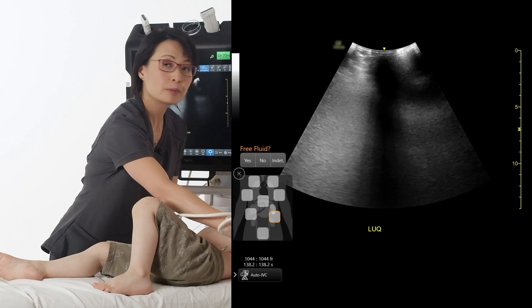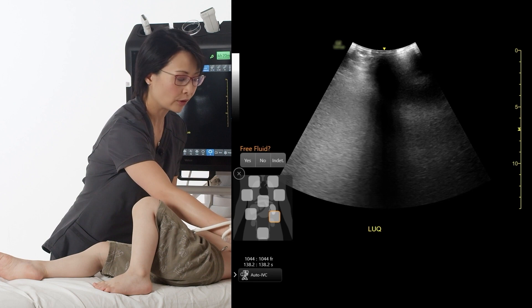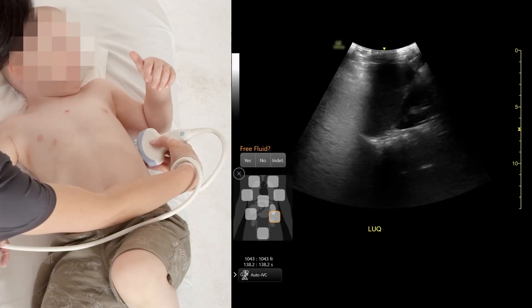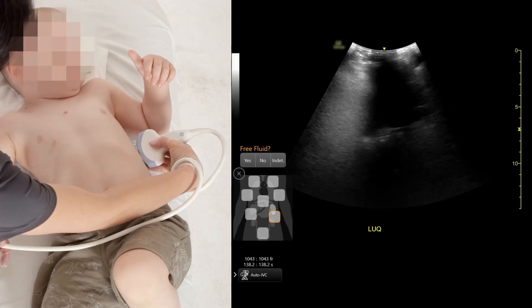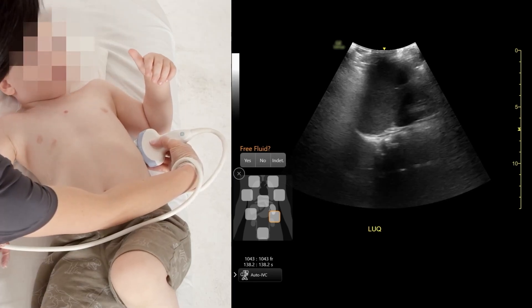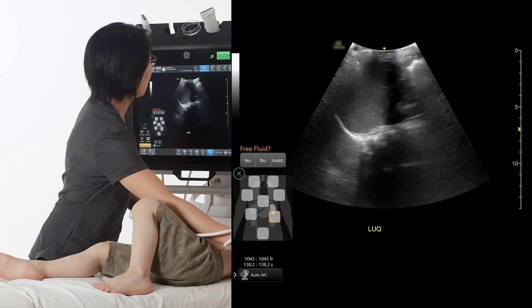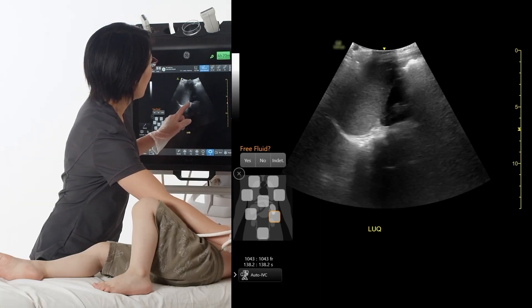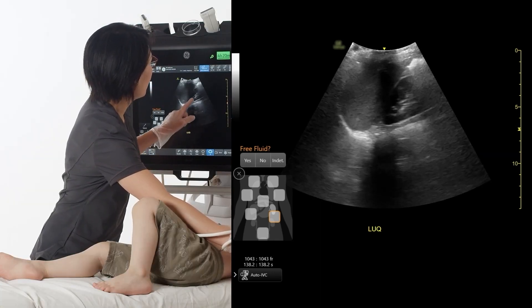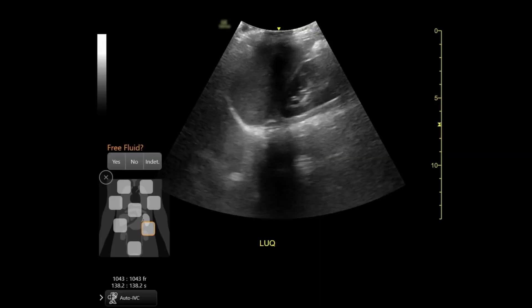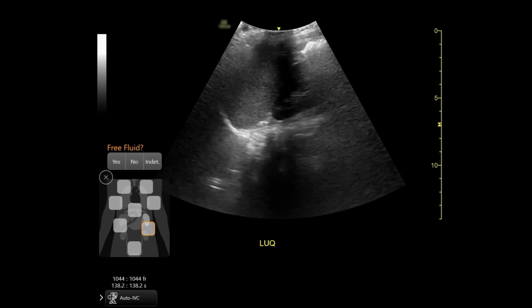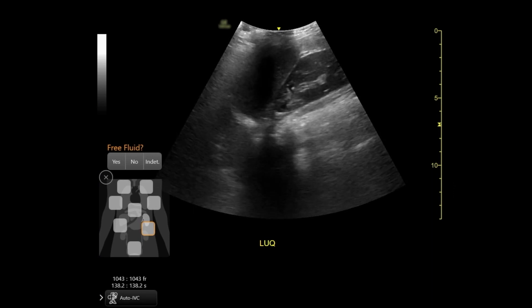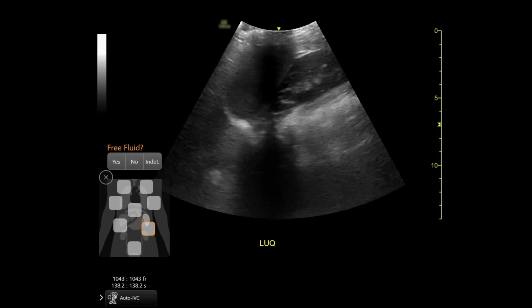You put the probe at the 9th or the 10th intercostal space of the left upper quadrant. And here we see the standard view is the kidney, the spleen, and the spine.